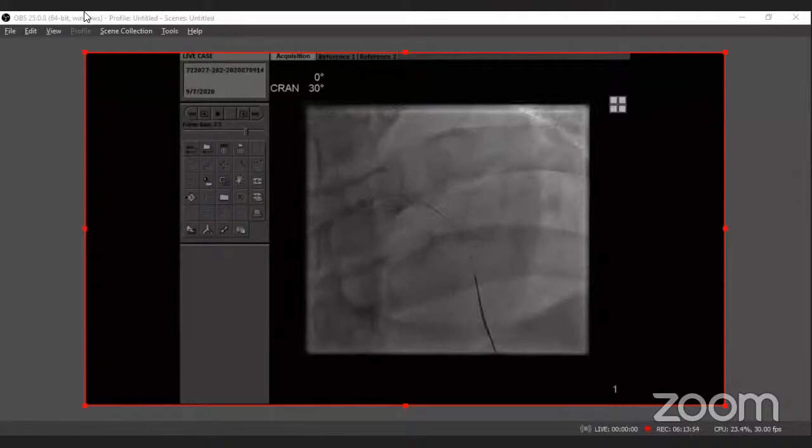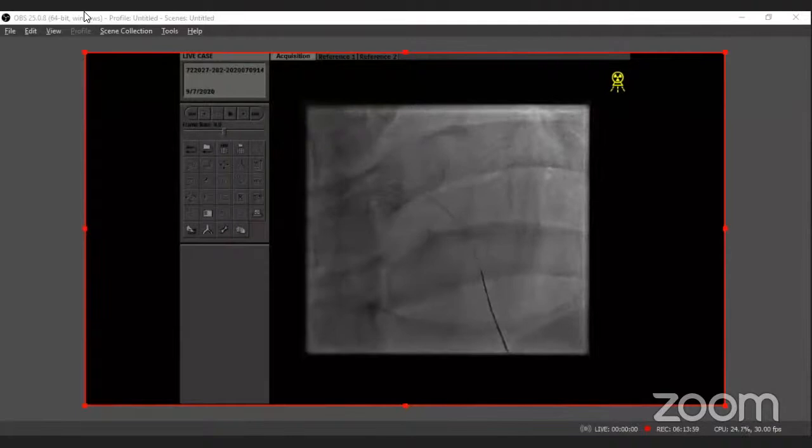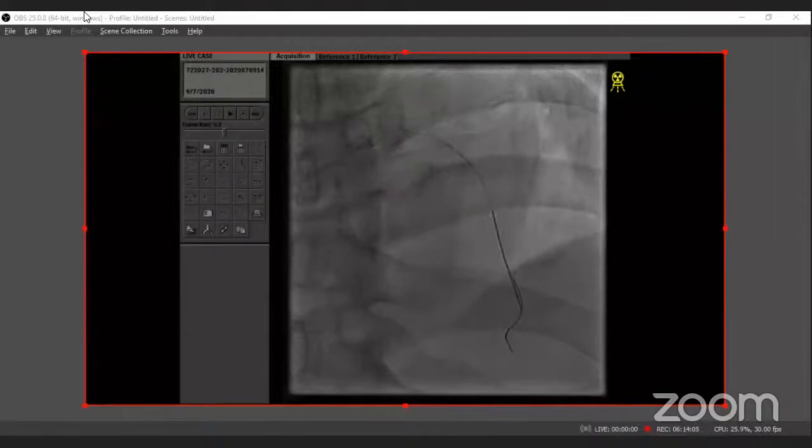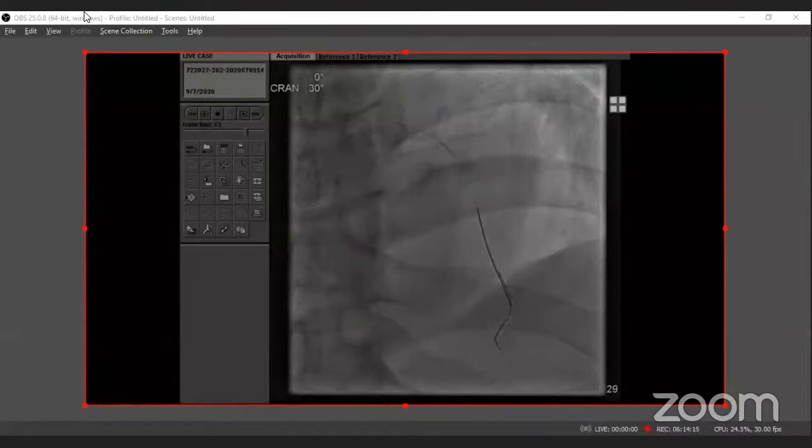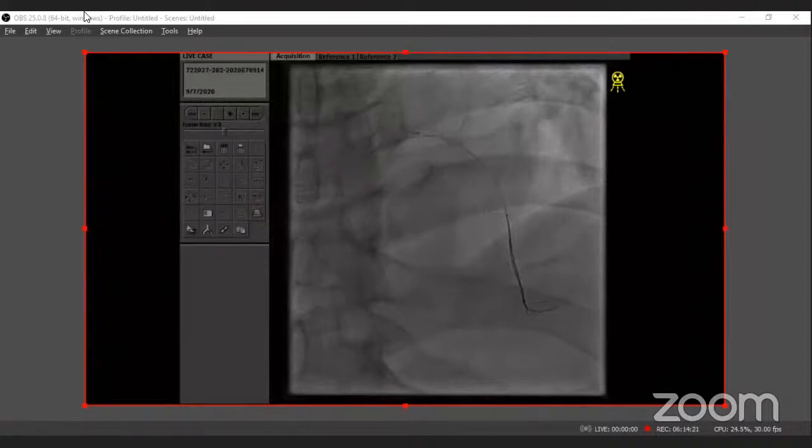Open up, please, Charlie. Open up. The wire. This is a new trio. So, as you can see, in this case, the wire is wrapped, so the trio balloon is not able to go in. So we're going to just take out the jailed wire. You pulling? I'm pulling, okay.